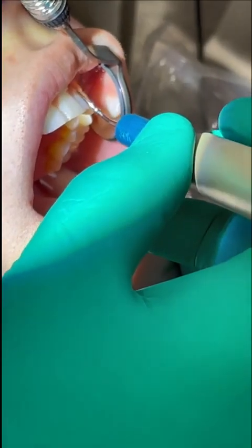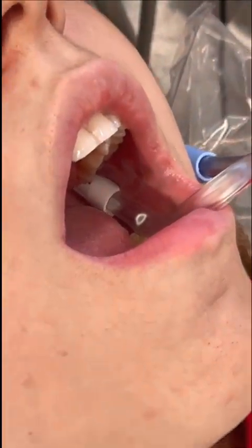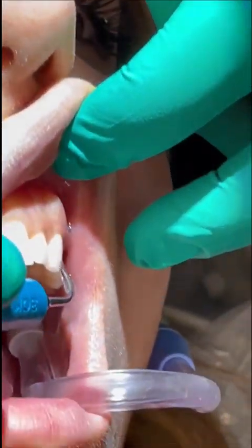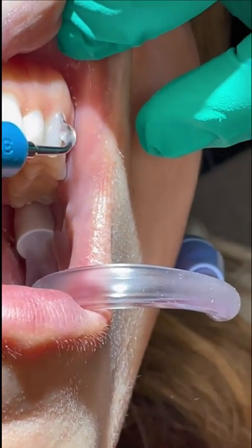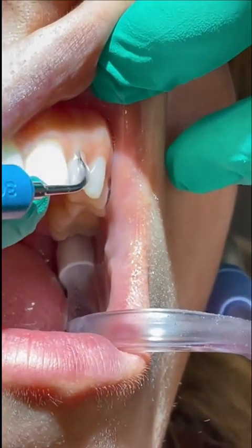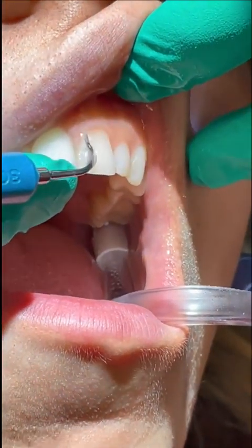Here I'm using my mirror for indirect vision on surfaces away from me in the posterior. When I get to the anterior teeth, I move my chair to the 12 o'clock position so I'm seated at the top of the patient's head. If you have set your water correctly, you shouldn't be spraying the patient in the face. If you keep the ultrasonic tip adapted to the tooth and subgingival, then the water will mostly be contained.